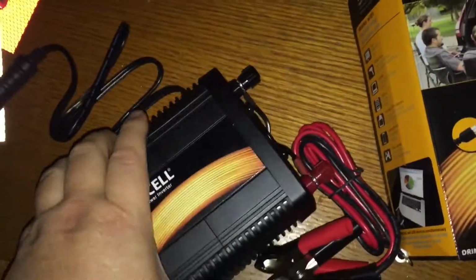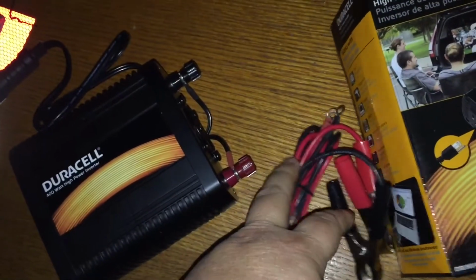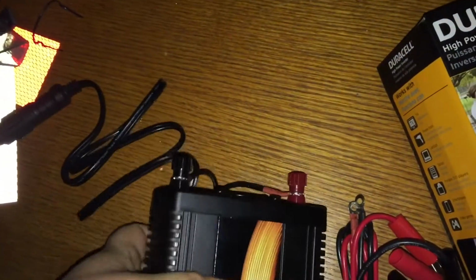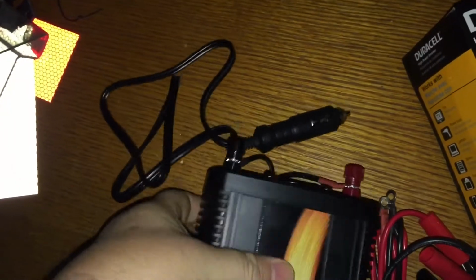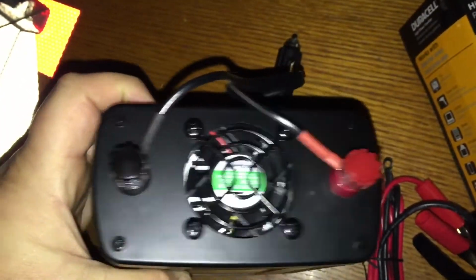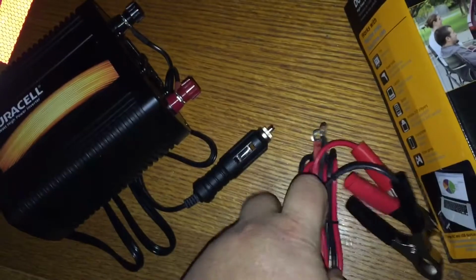Now you can hook it up directly to the battery, which if you're inside your camper, you really don't have a place to hook it up. So the other way to do it is use your 12-volt power supply or 12-volt cigarette adapter. It's easily wired right there. You can see the red for positive and black for negative. So don't mix those up. They just screw right on.